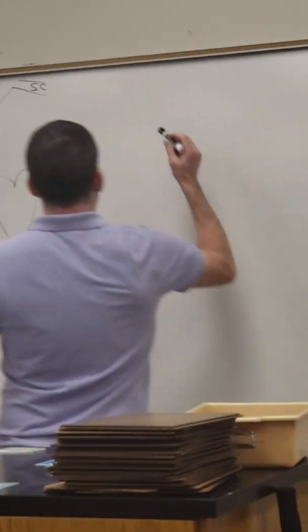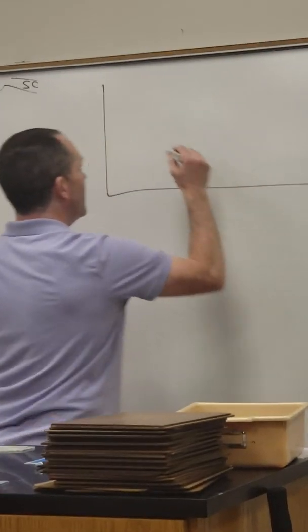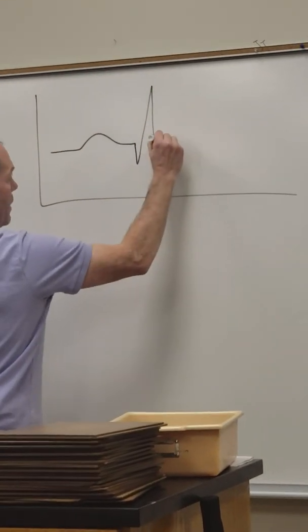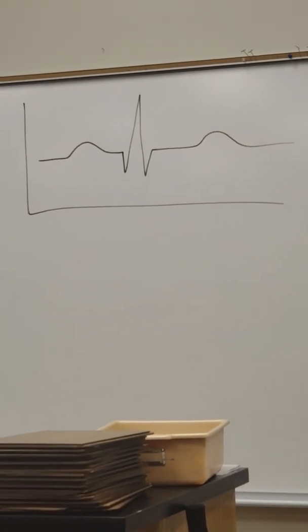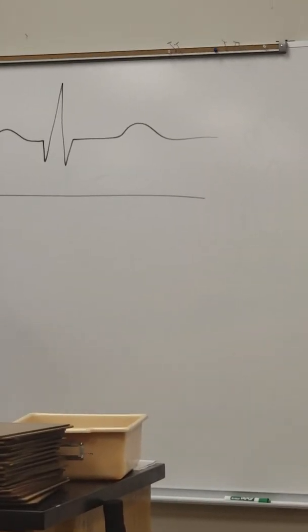All right, so cardiovascular physiology. There's often some confusion about this simple little graph. This is a graph, an EKG, or ECG, whichever you want to say, of the electrical activity of the heart.